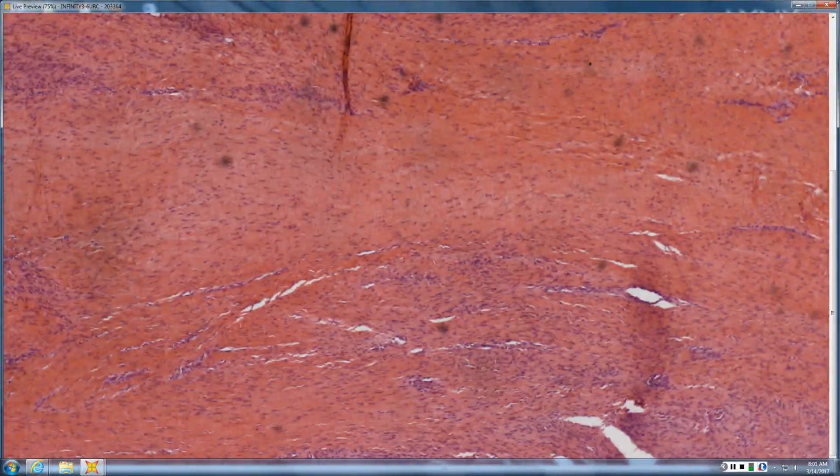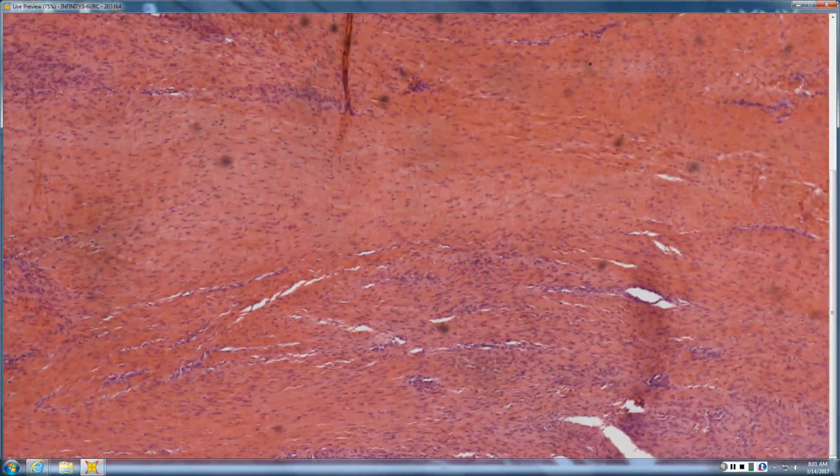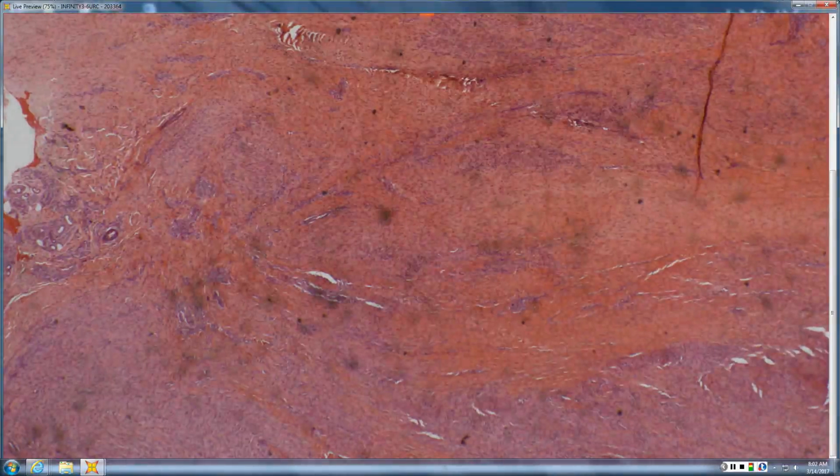And you get full credit for Jeopardy because you phrased it in the form of a question. Dupuytren's, Peyronie's, and ledderhose are palm, sole, genitalia, right? And they are nodules, so hypercellular nodules in a more fibrotic, less cellular background with corkscrew nuclei, corkscrew collagen.